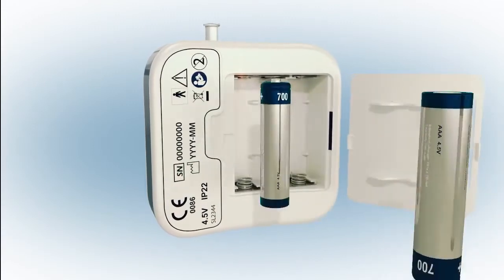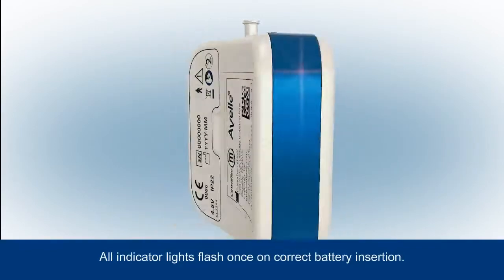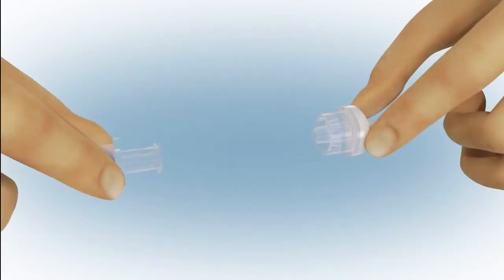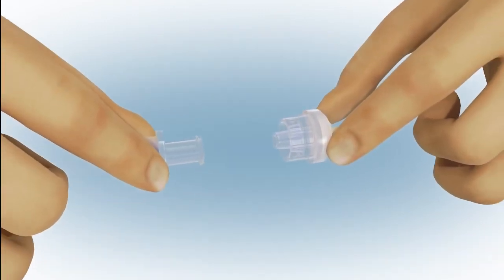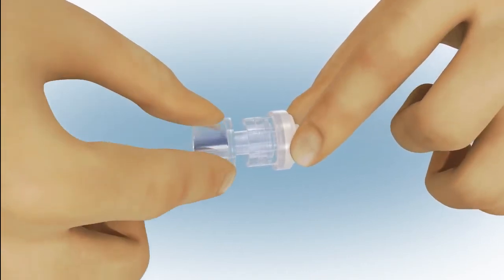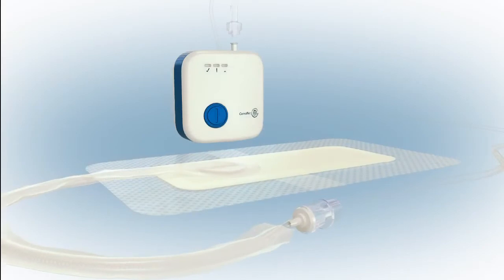Place the batteries as indicated in the battery compartment. All indicator lights will flash once. Next, connect the dressing to the pump. You'll need to twist together the connectors to ensure a secure connection between the dressing and pump tubing.